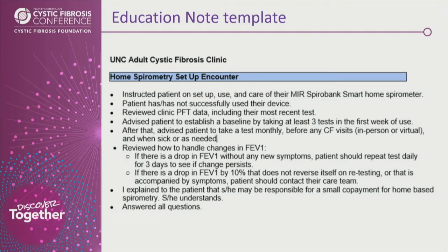This is our education note template. It lists all the points that we discussed during the visit with the patient, including advising the patient to use the device three times the first week they start with it, to help establish a baseline and get them used to using the device. We also discuss what to do if they experience a drop in FEV1 or if symptoms have occurred.